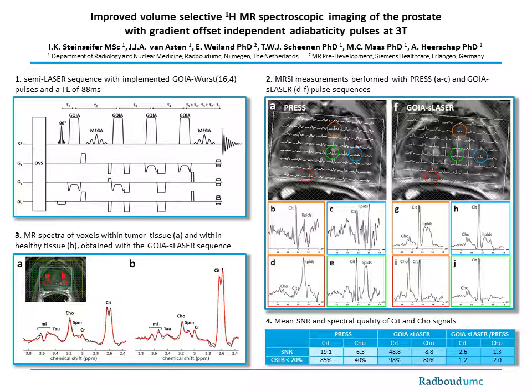Multiparametric magnetic resonance is increasingly used in the management of prostate cancer. Magnetic resonance spectroscopic imaging, or MRSI, may be especially valuable in assessing cancer aggressiveness, currently one of the most important challenges in prostate cancer management.